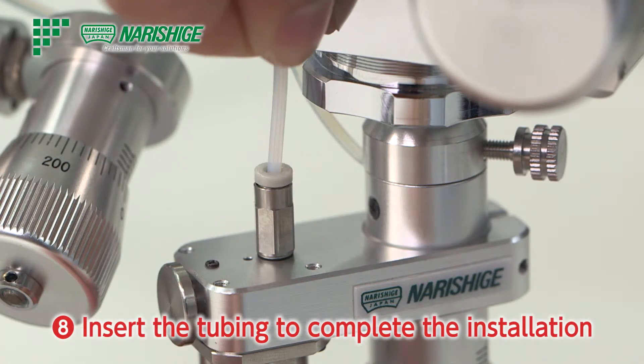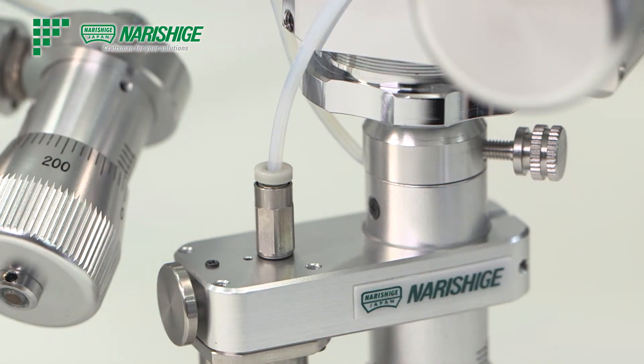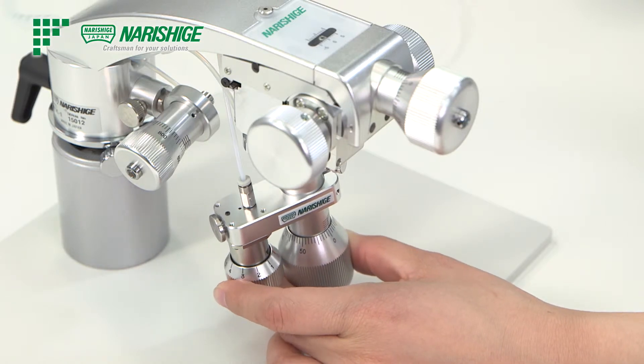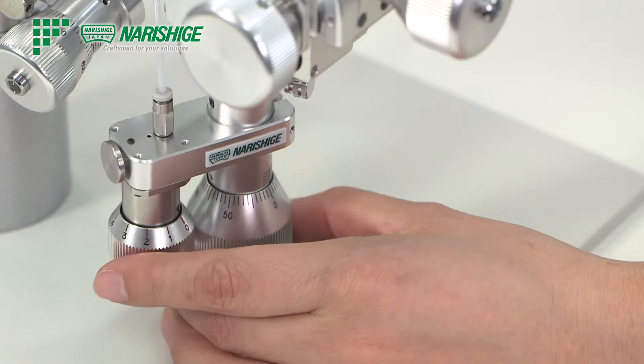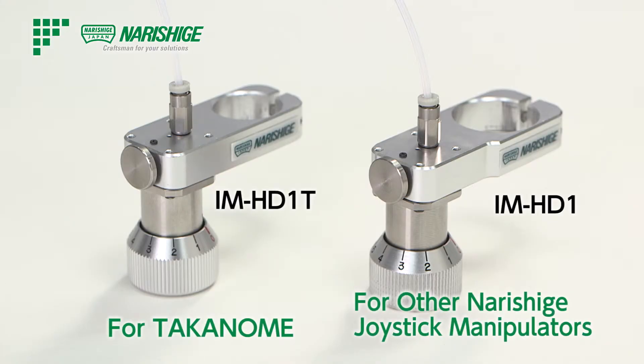Insert the tubing. This new pneumatic injector, capable of manipulating the oocyte with just the tip of your fingers, is available for our Takanome manipulator system as IM HD1T. IM HD1 is also available for other Narishige hanging joystick manipulators.